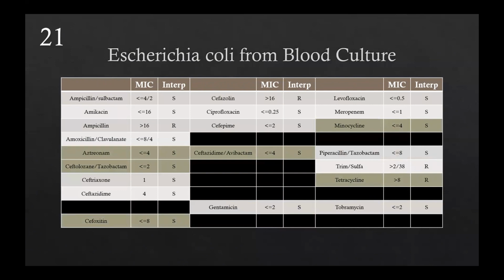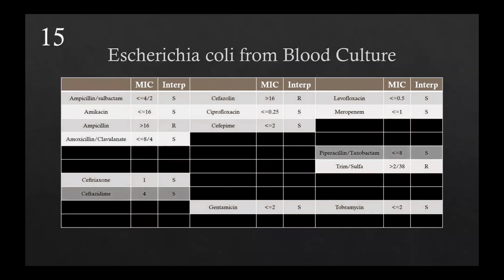When I say we, I basically mean the antimicrobial stewardship team wants to reserve these for certain purposes. We want to reserve ceftolozane-tazobactam, perhaps for multi-drug resistant Pseudomonas, if at all possible. Ceftazidime-avibactam for carbapenemase producers, if at all possible. So we have certain uses for these. We don't want them to be in general distribution. So we're going to take those off.